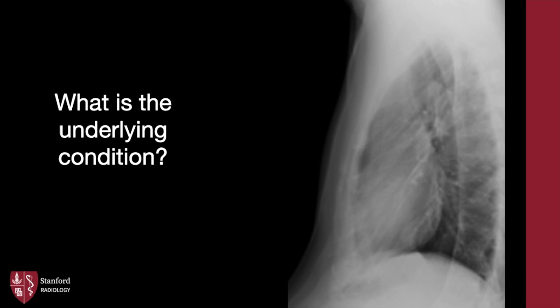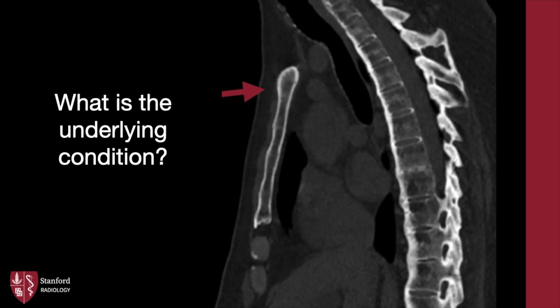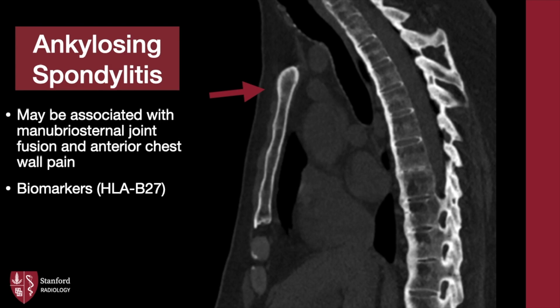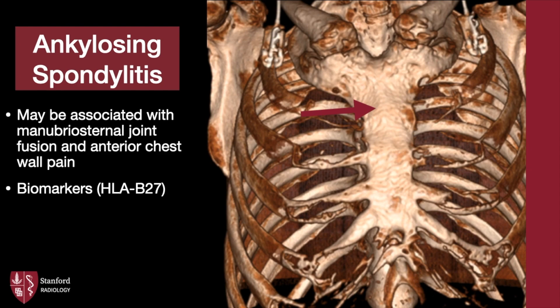Moving on to the next patient — what is the underlying condition? There are flowing anterior syndesmophytes in the thoracic spine. The manubral sternal joint is difficult to appreciate due to superimposition artifact, but sagittal CT better illustrates this area: the manubral sternal joint is entirely fused. Also note the diffuse fusion of the thoracic vertebral bodies and ossification of the interspinous ligaments, giving a bamboo appearance. This patient had ankylosing spondylitis. The manubral sternal joint fusion is commonly seen but not necessarily pathognomonic — other causes for fusion may be developmental or Paget's disease.